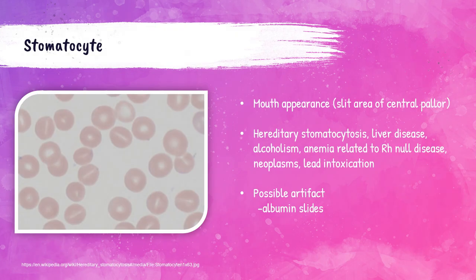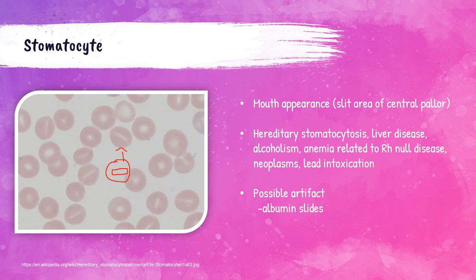These red blood cells are called stomatocytes. They kind of look like they have a slit-like or mouth-like appearance to their central pallor. These cells are seen in patients with hereditary stomatocytosis, those with liver disease and alcoholism, and patients with Rh null disease — which you'll learn about in blood banking — where patients have a lack of expression of all Rh antigens.